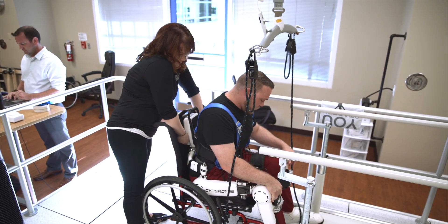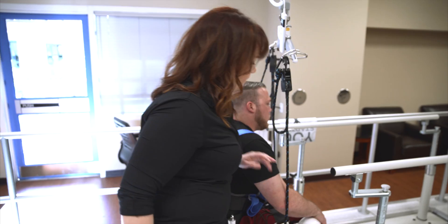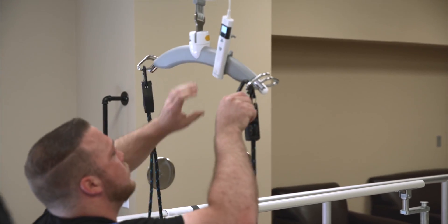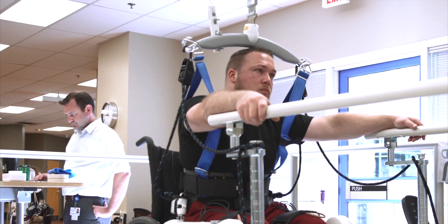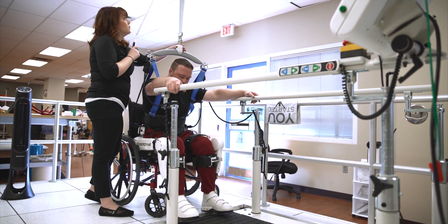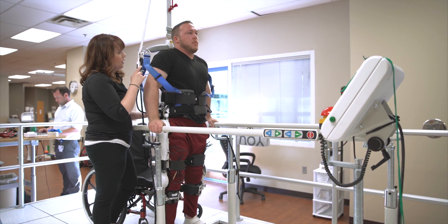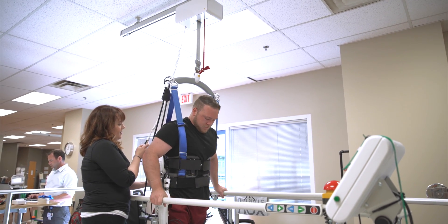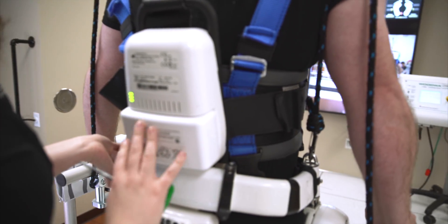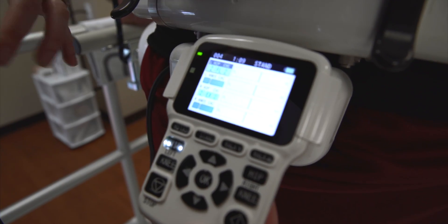I'm putting the battery in and taking the back of the suit. I'm going to turn it on so it has a couple of minutes to warm up while we get everything else set. This is the battery I put in to turn everything on, and there's the main power switch over here. This is our remote that we use to read the different signals and control the robot to get it to be the right settings for what he's doing.